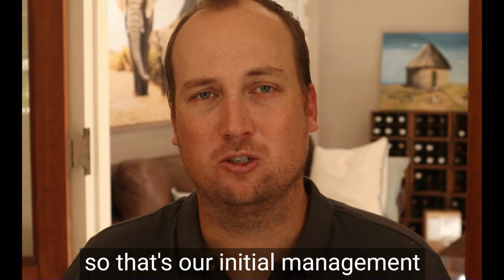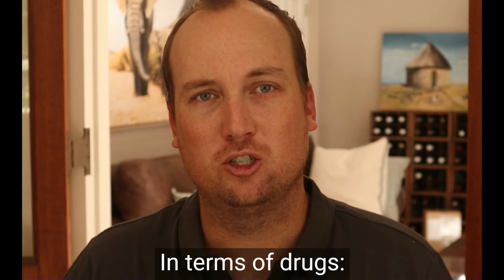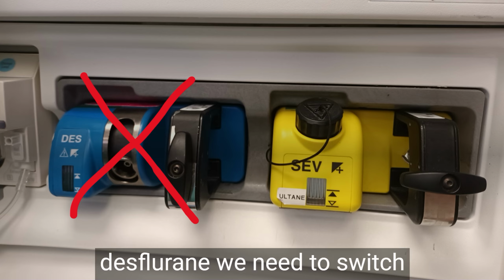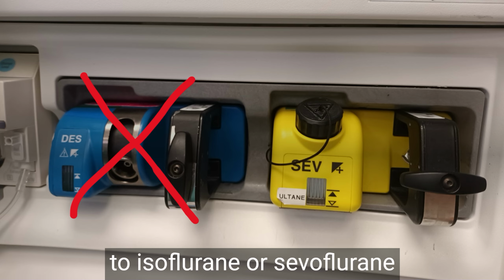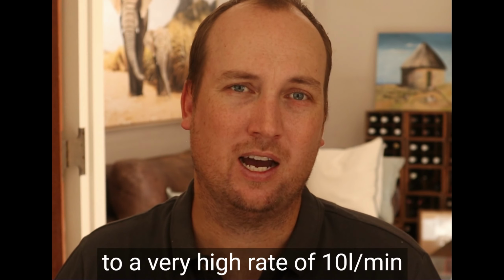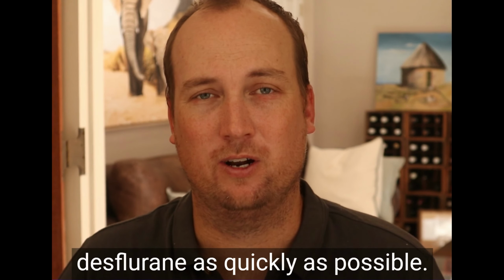So that's our initial management and our initial ventilator settings. In terms of drugs, if we are doing a volatile maintained anesthetic with desflurane, we need to switch off the desflurane and change to isoflurane or sevoflurane and increase the fresh gas flow to a very high rate of 10 liters per minute so that we can wash out the desflurane as quickly as possible.